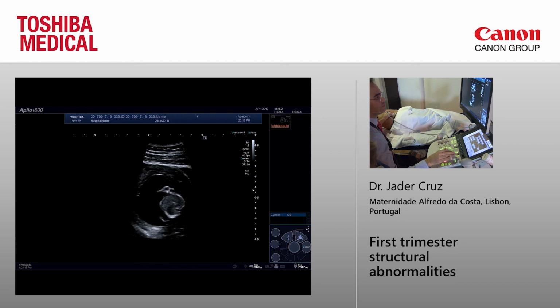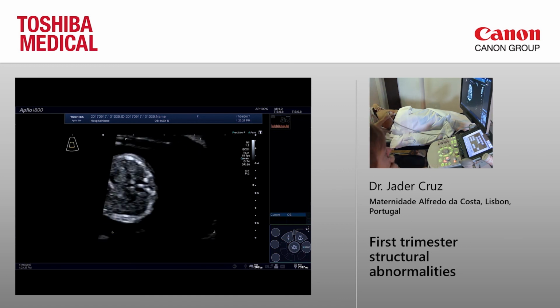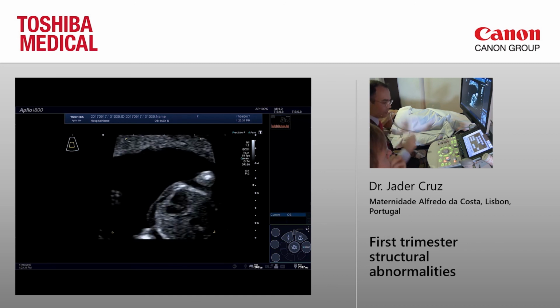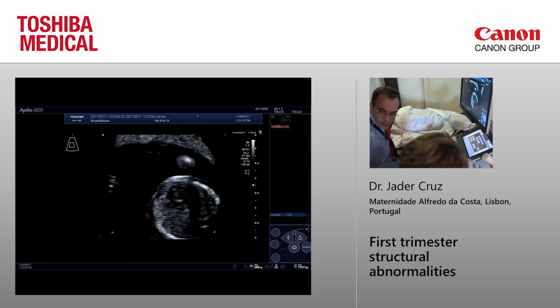Of course. Why measuring ductus venosus PI at 12 weeks? I mean, isn't just the waveform the most important thing at 12 weeks? No. For heart assessment, the A wave is important.